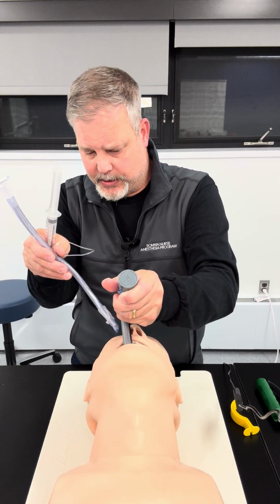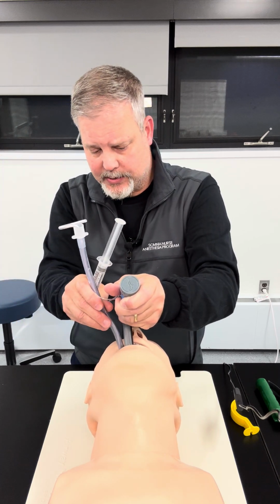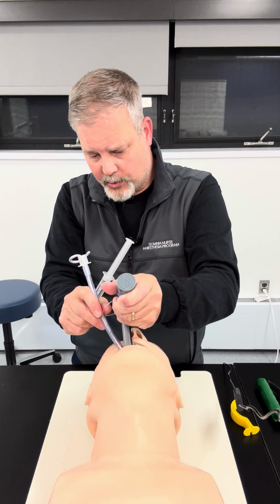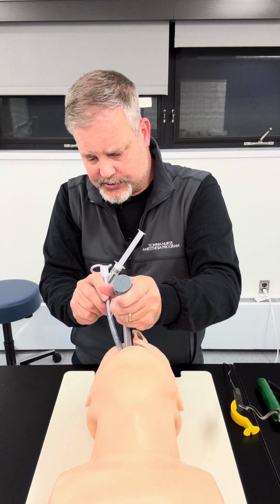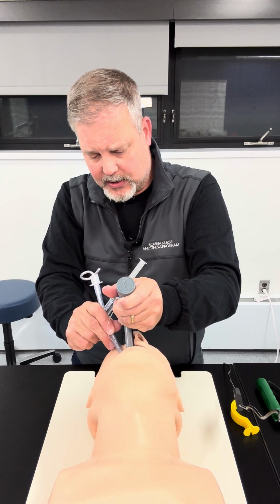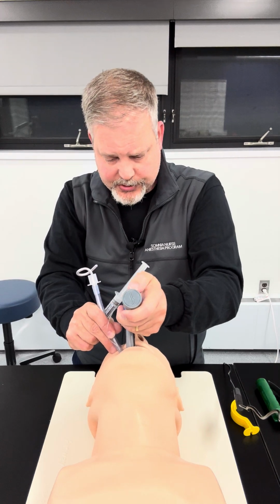So now what I'm going to do is take my endotracheal tube and slide it into the oropharynx, and I'm going to guide it with that stylet all the way through the vocal cords. Now, as soon as my pilot balloon there, my cuff, excuse me, gets through the vocal cords, then I'm going to stop.